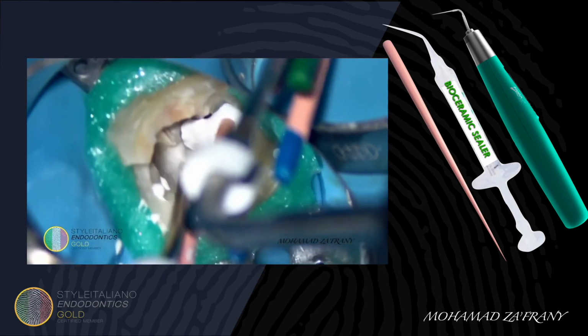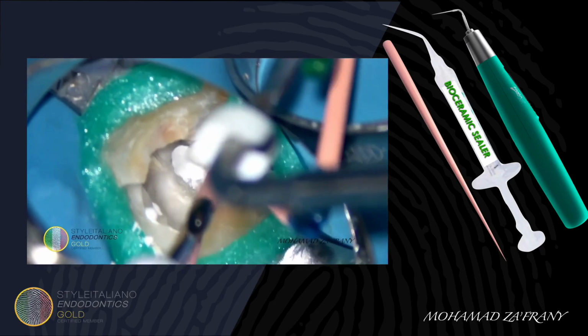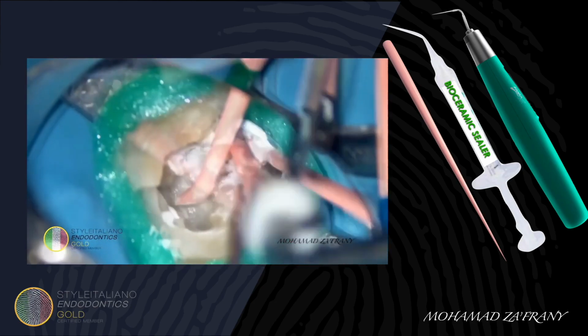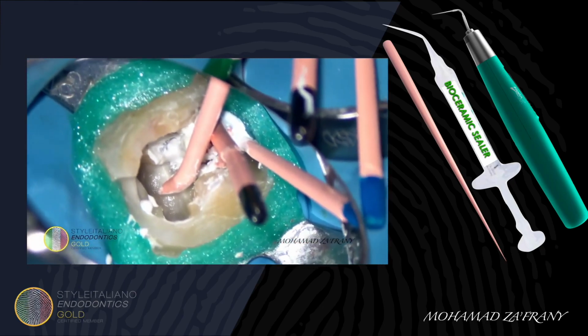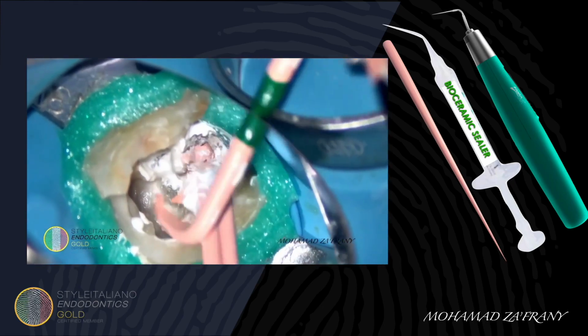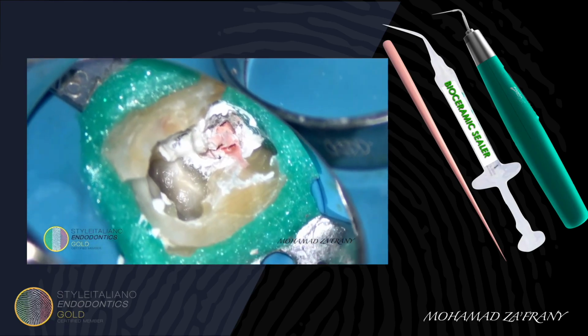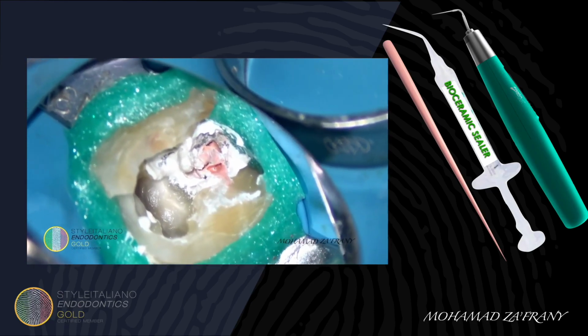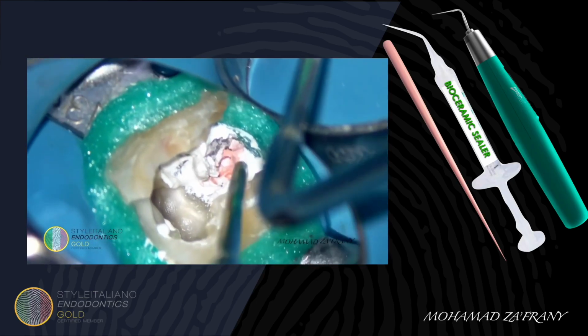With the heat carrier on low temperature, I'm sealing off the master cones. Then compaction using a suitable plugger.